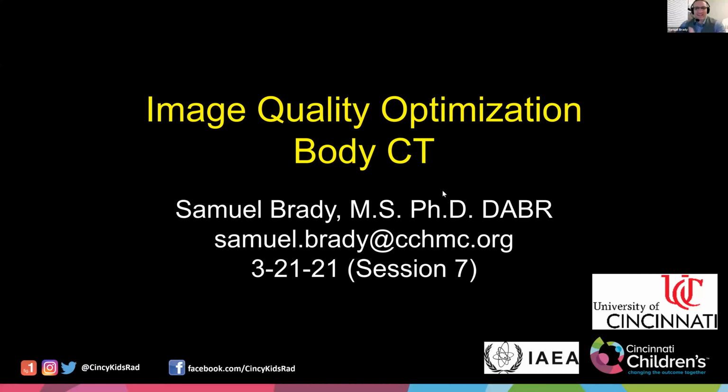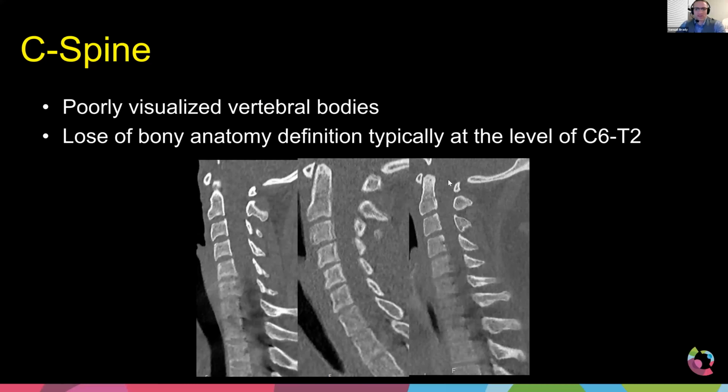Anyway, so just like Tanya mentioned in the introduction, we've started down the path of CT. We've been talking about neuro last week. So today we're going to focus in on the body. But before we do, I actually made a promise. Right at the very end of our lecture series last week, we were discussing C-spines, which of course sit right between the body and the head, but are almost always read by neuroradiologists and are typically grouped with head protocols.